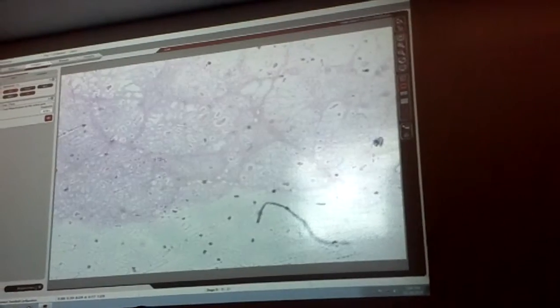So it's making everything kind of swell out, and so you're pushing all those lobules together, and that interlobular connective tissue decreases. And then the adipose, again, generally you'll see it on the very edges, if at all, because it too is going to be smushed out a little bit here. So there's some adipose there.